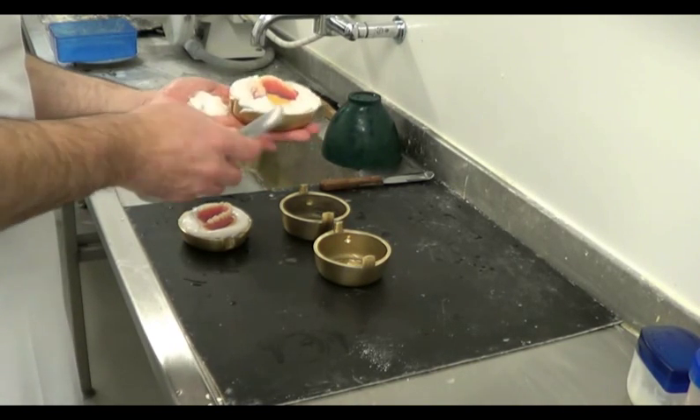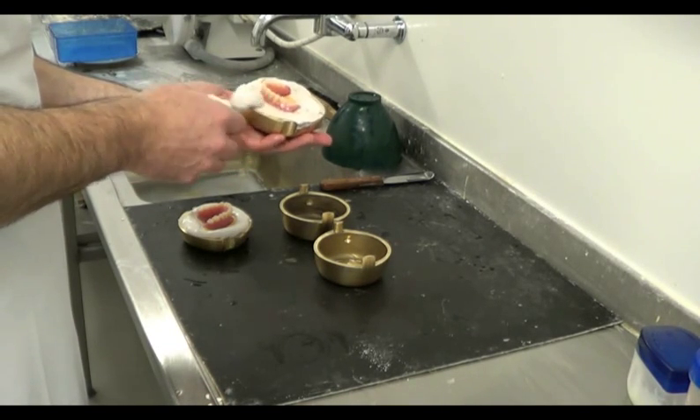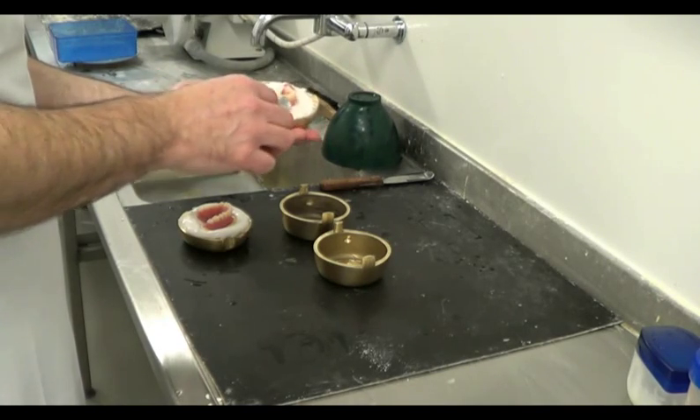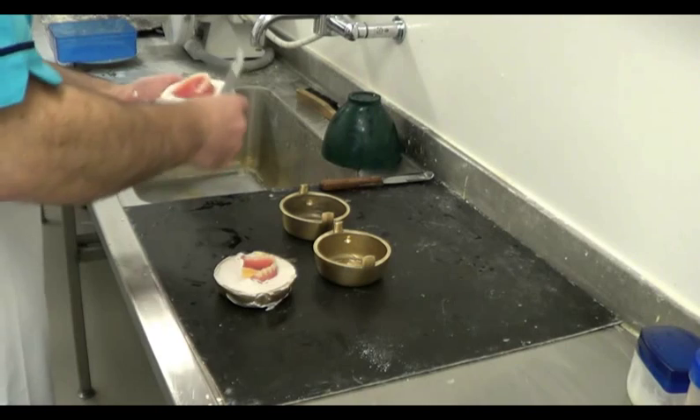Before the plaster sets fully, we can run the flask under the tap and use a brush to remove any excess, and then use a finger to achieve a final smooth finish. Repeat the process for the other arch.